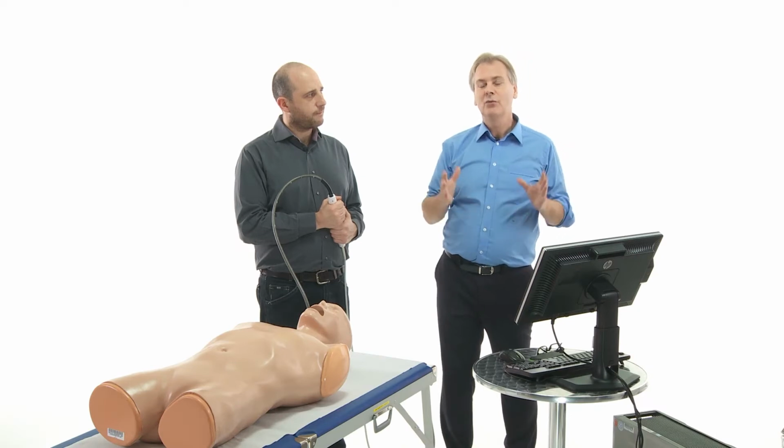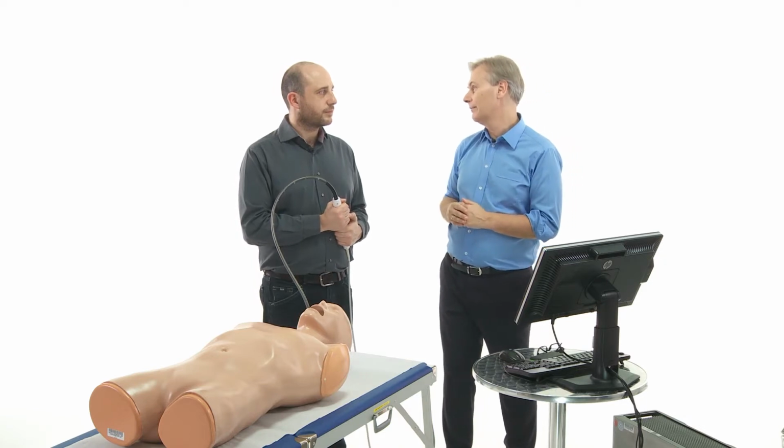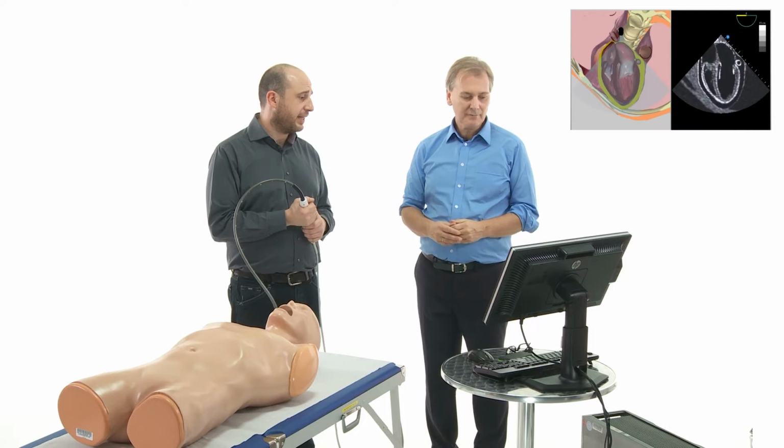I think you already realized that transesophageal echocardiography is performed differently if we perform it in an echo lab or on the intensive care unit or the OR. But I would like to ask Bruno, what is the value of the transgastric view in his clinical scenarios in his patients? Yeah, Thomas, for us it's very important, all the transgastric views. The first, because of the ventricular function determination for the right and left, and later we will see for the aortic valve too.